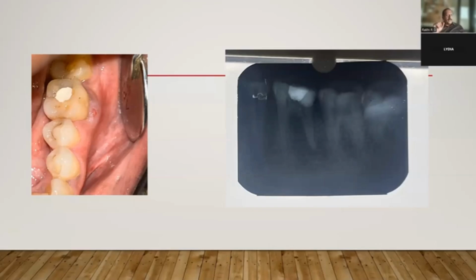Whereas if that particular tooth has a periapical infection, four surfaces may be favorable, but the fifth one, the apex, may not be favorable because you have the inferior alveolar canal apical to it. That makes it difficult to plan an implant in that region. Understood. A periapical radiolucency plus an inferior alveolar canal next to it. So you won't have any control over the apical area. An immediate implant gets its primary stability from the periapical region, not from the surrounding region.